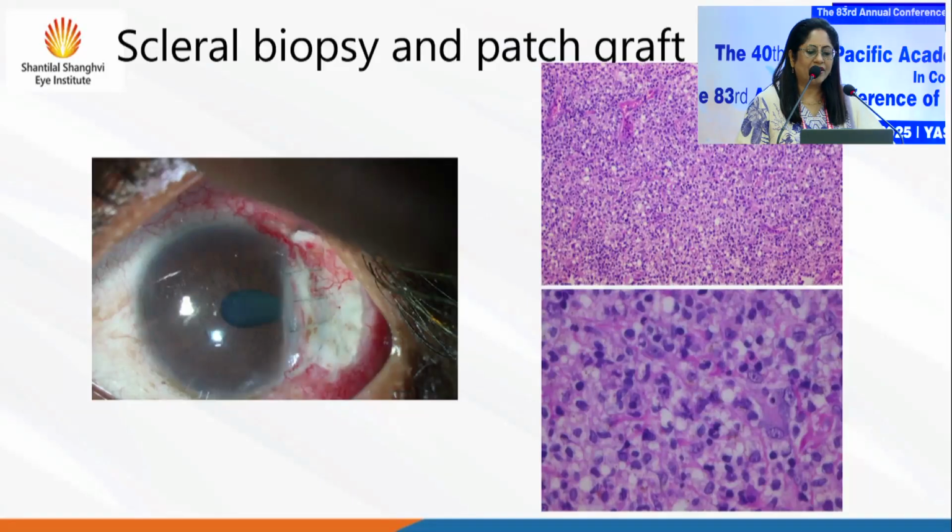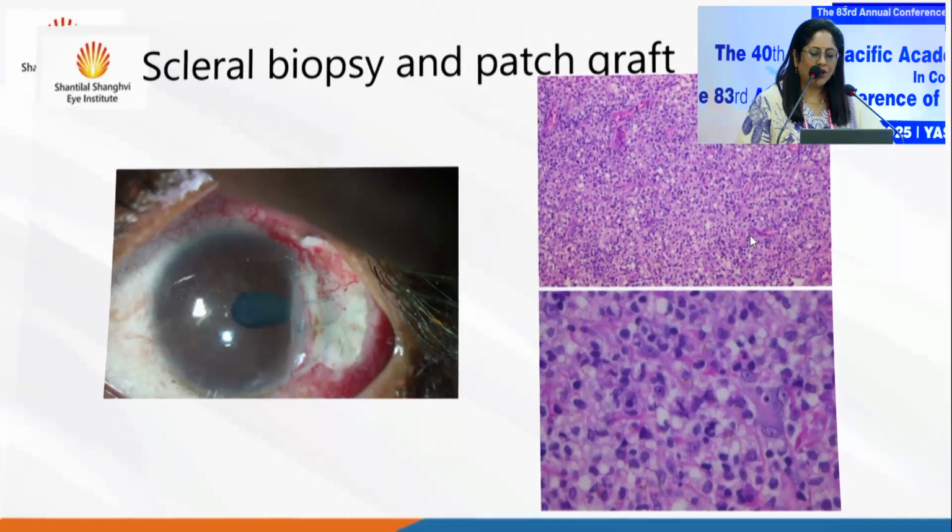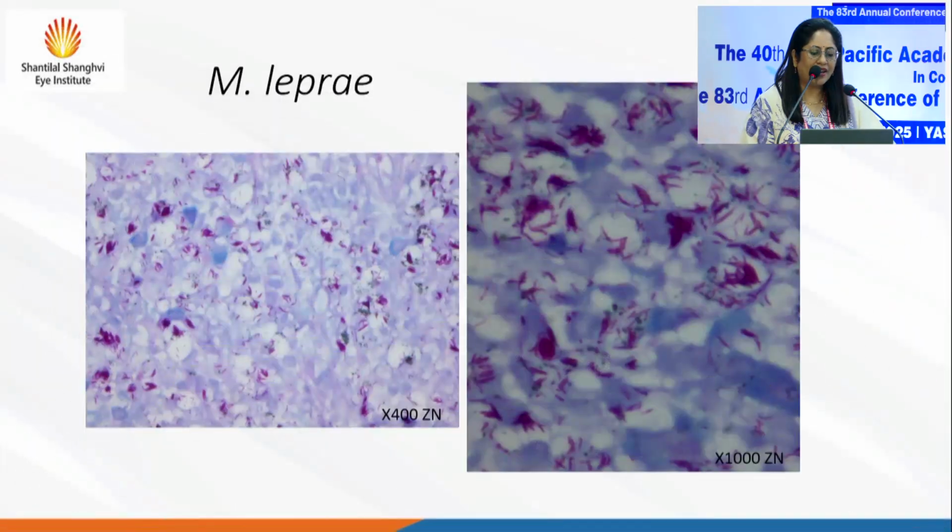This is what the patient underwent, and what you can see is chronic inflammation, and when we go to the special stains, the nodule was teeming with Mycobacterium leprae. The patient also had a slit skin biopsy from the skin of the ear pinna, and that also showed leprae bacilli, and the patient was started on Hansen's treatment, but he kept defaulting on the treatment and ultimately was lost to follow-up.